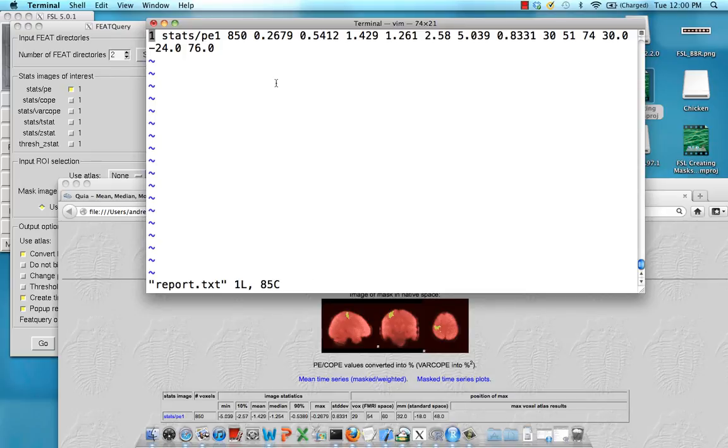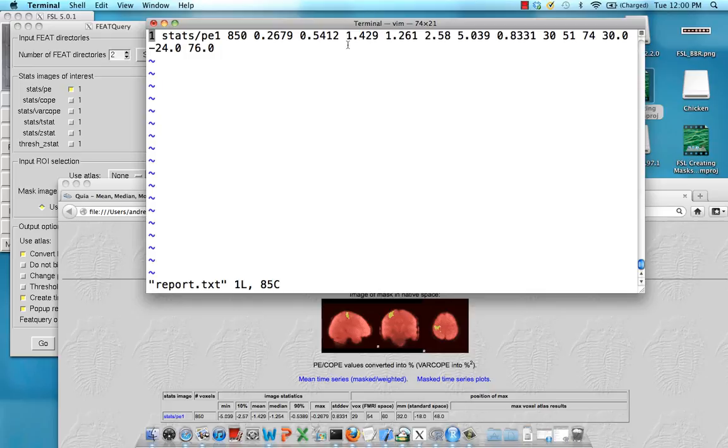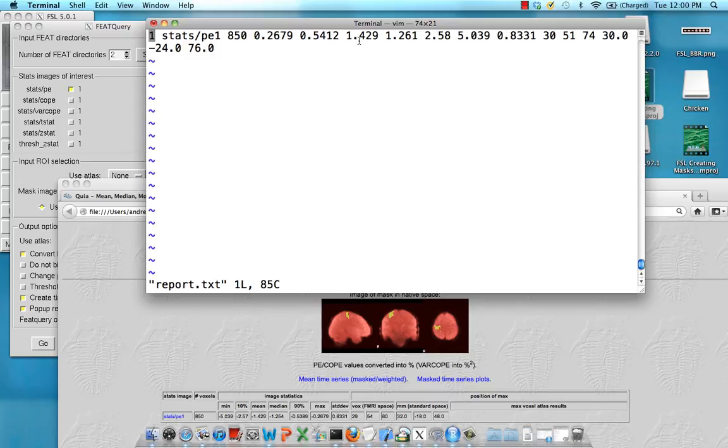So, in other words, this column represents the number of voxels. This column represents the minimum. And right here, this column right here, column one, two, three, four, five, six, that is the mean. And so, when you do this for multiple subjects, that's really what you want to focus on and what you want to extract for input into Excel so that you can compare parameter estimates for a given contrast across lots of subjects.